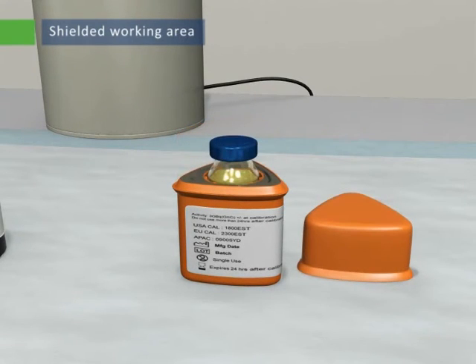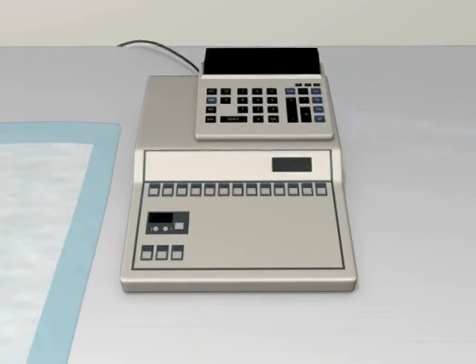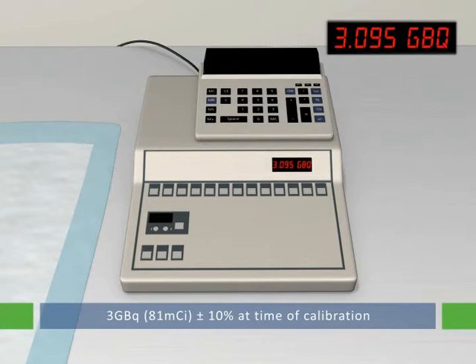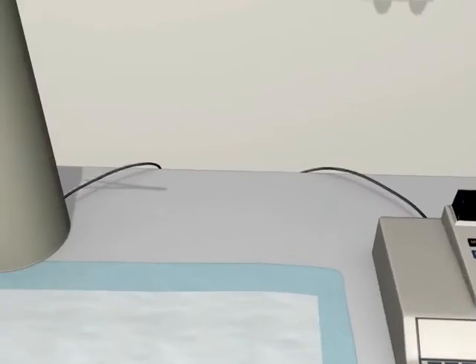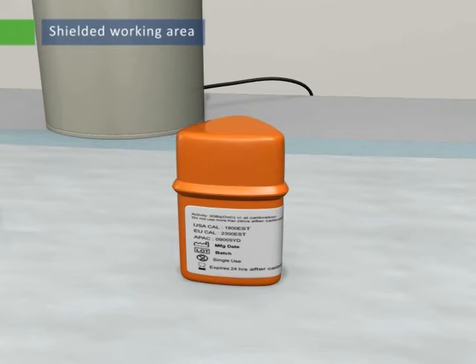Quickly open the pot and remove the shipping vial with tongs and determine the total activity using an appropriate ion chamber or dose calibrator. Record the activity, which should be 3.0 GBq or 81 millicuries plus or minus 10% when adjusted to the date and time of calibration. Note: accurate measurement requires fully suspended microspheres, so it is important to make all measurements quickly. Return the shipping vial to the lead delivery pot. Replace the lid and determine the volume of microspheres to be withdrawn from the shipping vial to provide the required patient radiation dose.